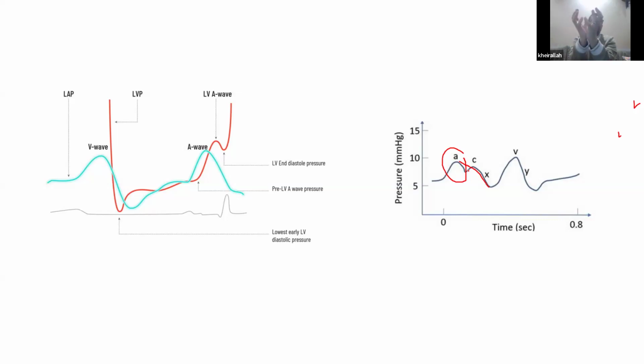And the left atrium is what is relaxing. Yeah, well, the valve is closed, it's relaxing. So I expect the pressure to go precipitously down, but that's not the case because the C wave is a sudden elevation. This comes because of the bulge in the annulus backward with systole.